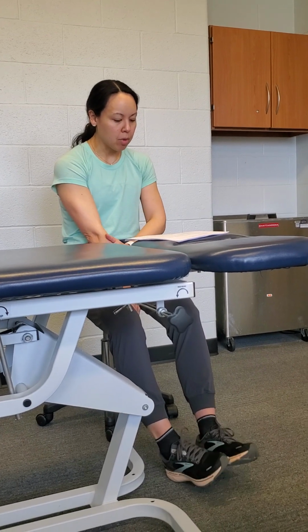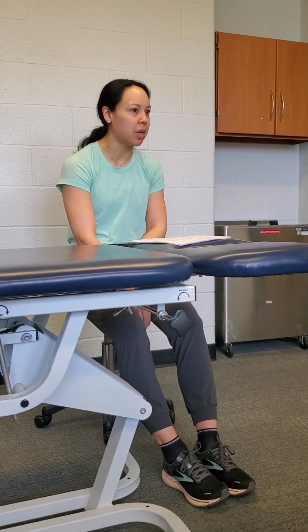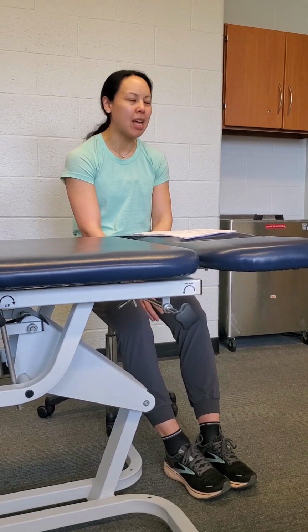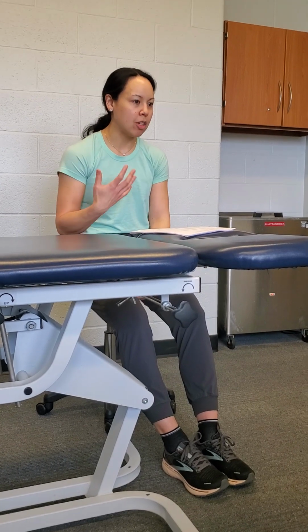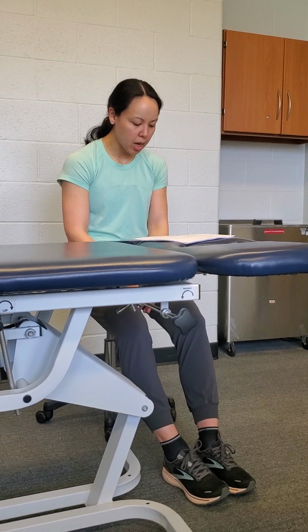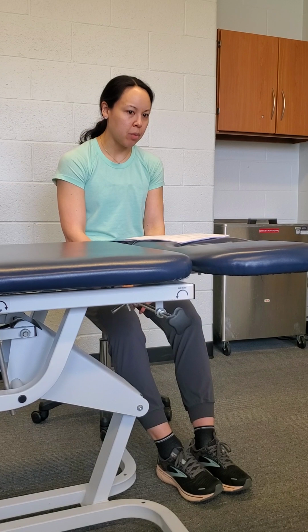To improve vascularity of a joint, the limb occlusion pressure is typically higher at about 80%, and that's if you're using it for pain modulation on that patient who's post-op day 3 and they're really struggling with a lot of pain and they're just not tolerating any exercise. That's when you do more of the passive BFR and you're just trying to help modulate their pain, get some blood flow and that type of thing. Machine exercises are typically best. It's a great way to do it more objectively too, and track how much load you're using.